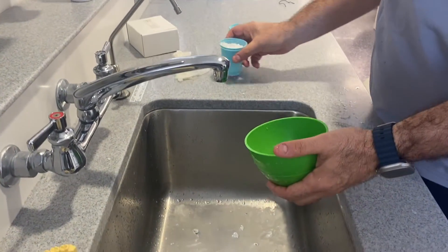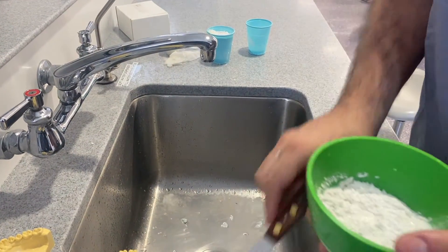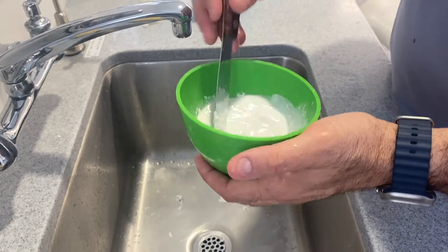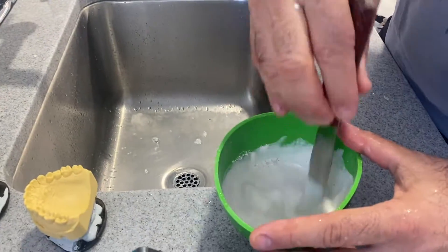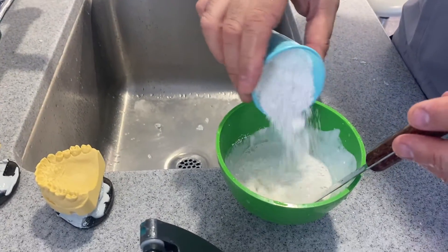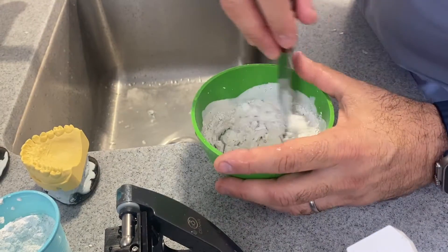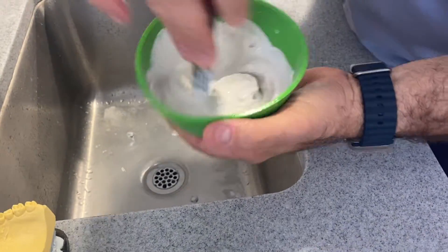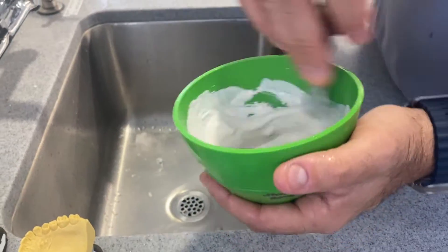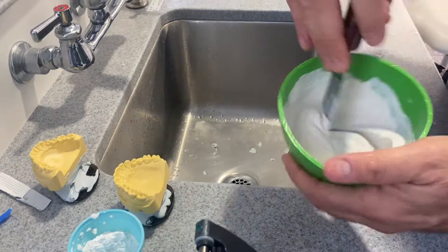I'm going to mix some plaster. Plaster acts a little differently — we don't need to measure it, but you want the right consistency. A too runny mixture is terrible. With plaster, you can add more powder to get the right consistency. We always hand mix — we don't vacuum mix these materials. What would you vacuum mix? The stone you use for your casts, Type 3 stone.